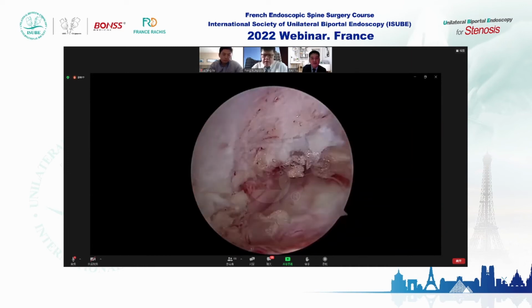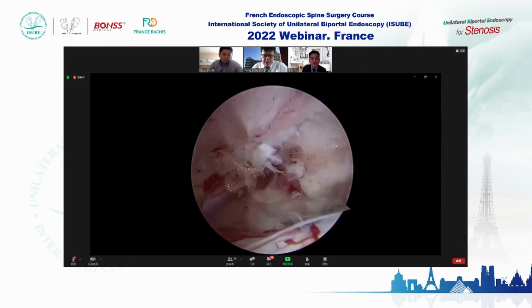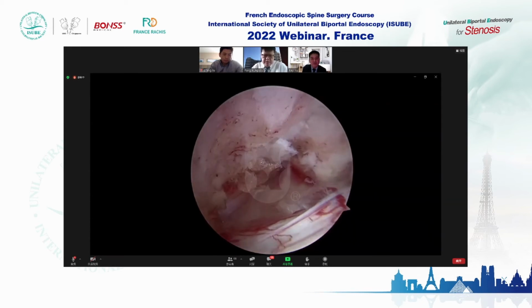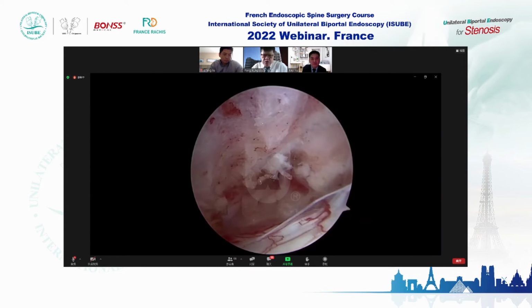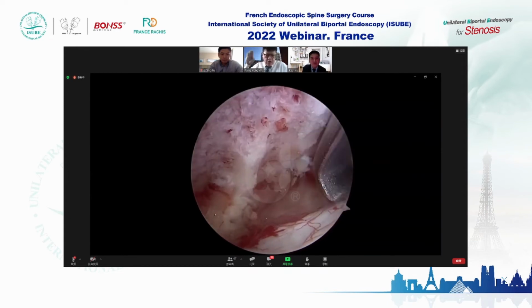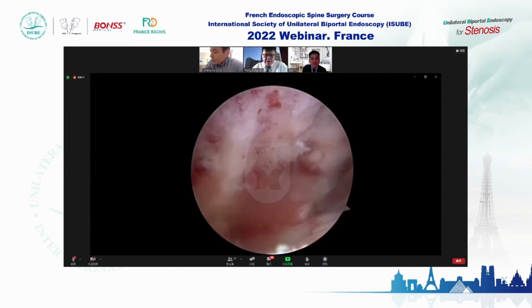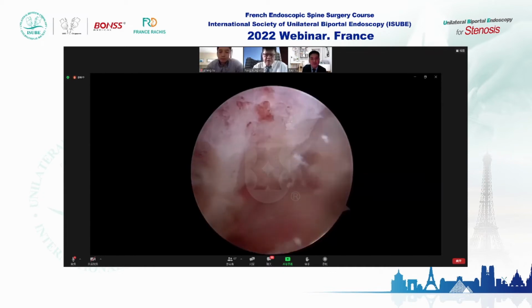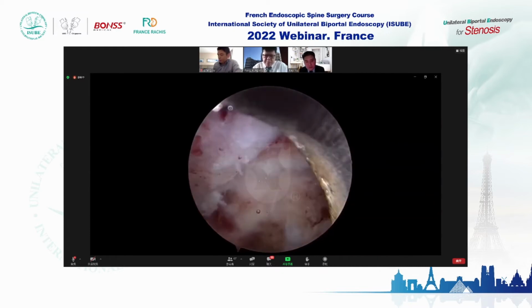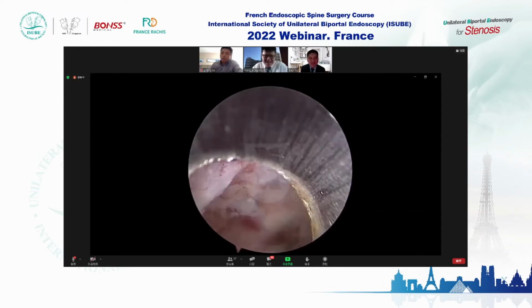In terms of SAP preservation, I think to be fair, both can preserve the SAP. It's just a different part of the SAP that is being preserved. For the contralateral approach in biportal, I will preserve the lateral and dorsal aspect of the SAP, while with the transforaminal approach, we only take the front, the ventral part. So I think the dorsal part of the SAP is preserved. I think both are stable. Okay. Thank you for your comment.